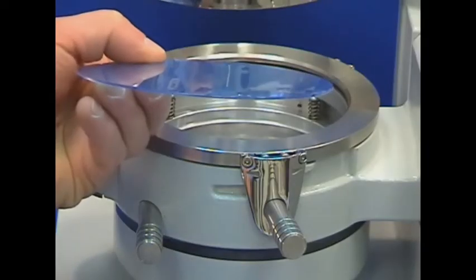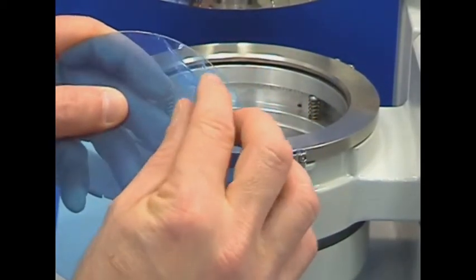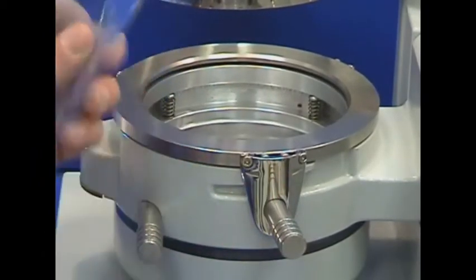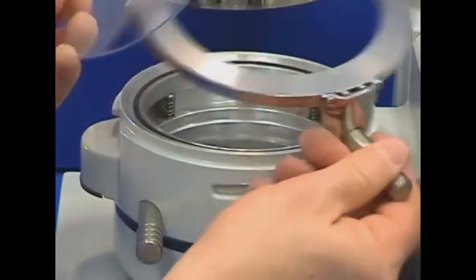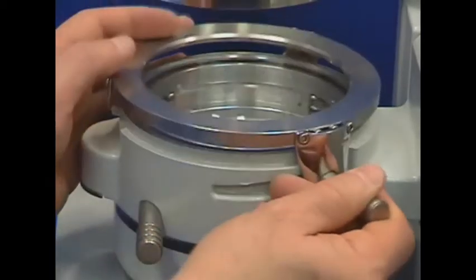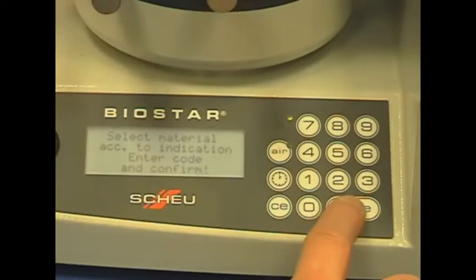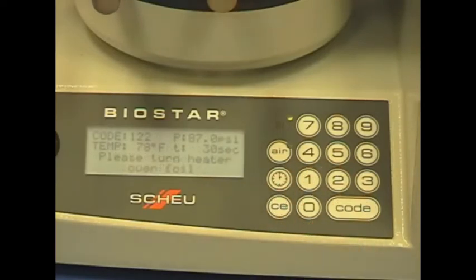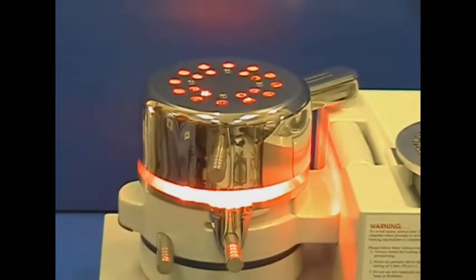When using Invisicryl A, a film must be peeled from each side of the plastic. Then it is placed on the pressure chamber and clamped into place. Enter the heating time or BioStar code into the machine. Swing the lamp over the clamped material to start the heating cycle.